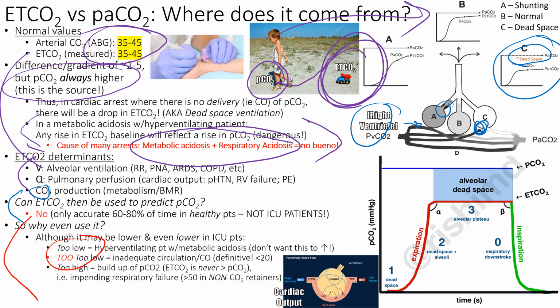It's like less than 20, it's cardiac output no matter what, right? It's not going to be less than 20 because of a breathing situation. It's less than 20 usually when there's a cardiac output situation. The blood pressure is going down, the heart's failing. Those are situations where we have an end-tidal CO2 less than 20. If it's like 25, 28, that's someone that's breathing fast or slow.